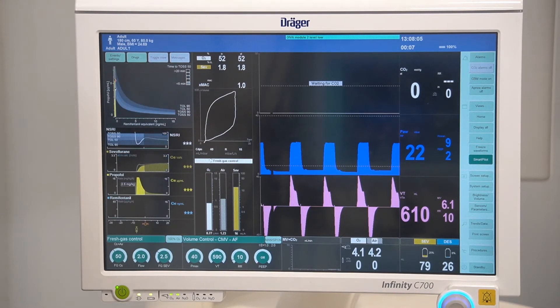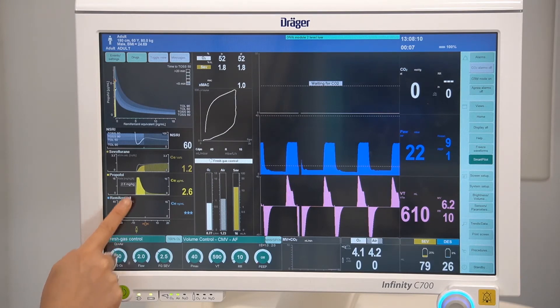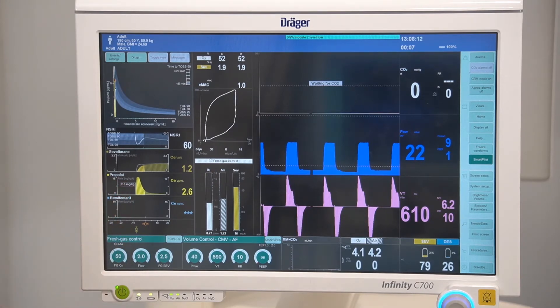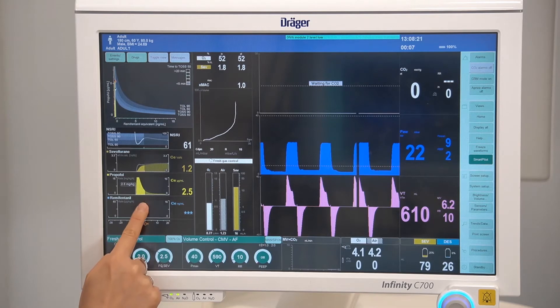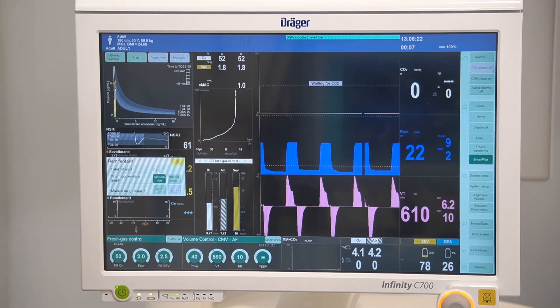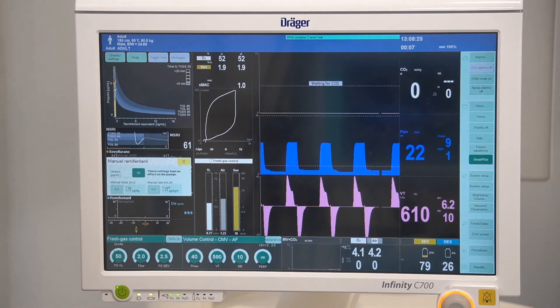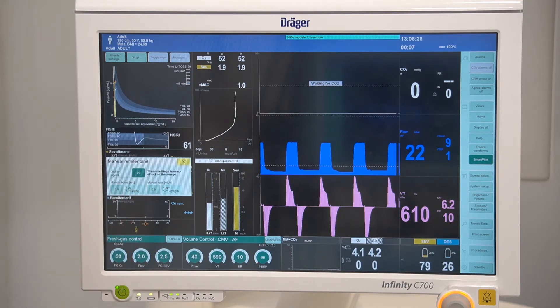A yellow timeline will then be displayed. Using the rotary knob, select the time the dose was given, and then confirm. A colored syringe icon will now be displayed corresponding with the information that was entered. To enter a manual remifentanil dose, tap on the box, select the syringe icon, and enter a manual bolus or rate.